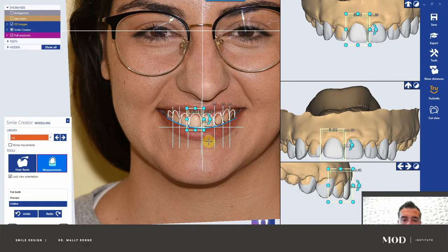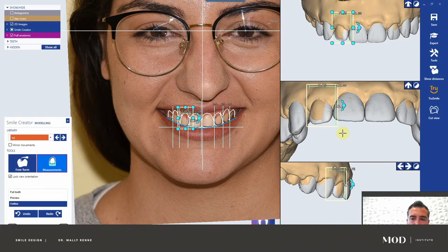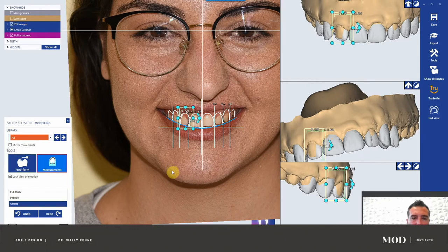What I'm going to do now is actually get out of this smile design module, because I like to make most of my changes in the normal software — it's much faster and easier. We still need a few things to do in this module though. We need to pick the color of her teeth. You could click any one of these colors or drag the mouse to go in between various different colors. She's obviously going to want a brighter smile, so I'd probably go with an A1.